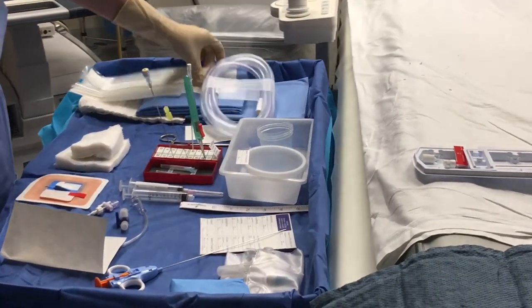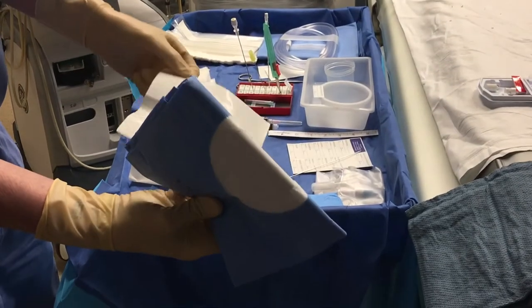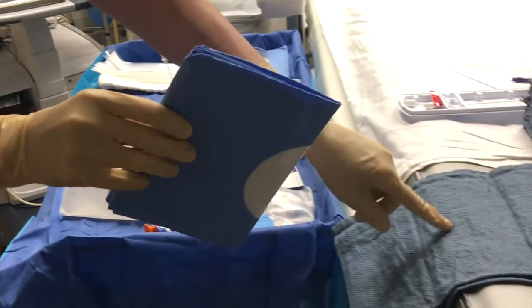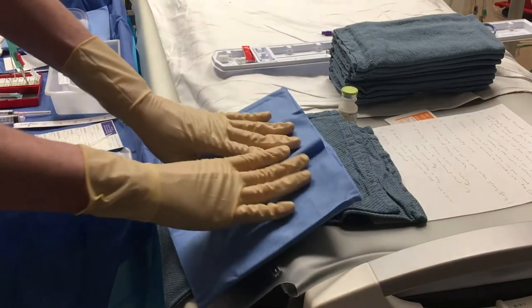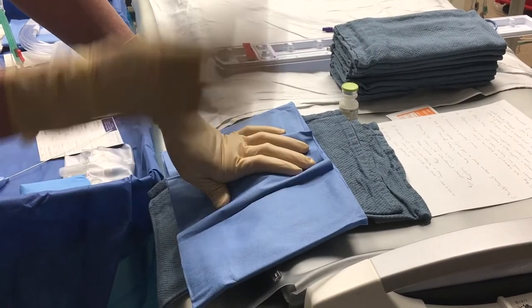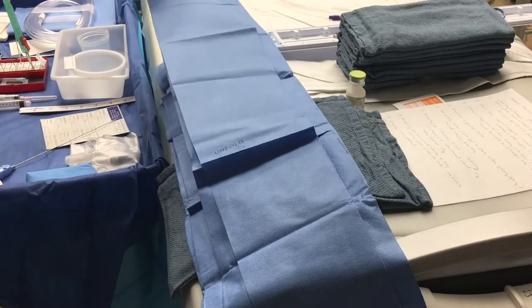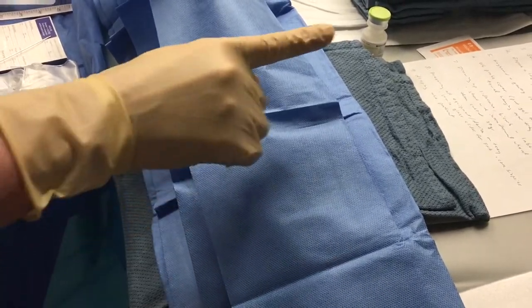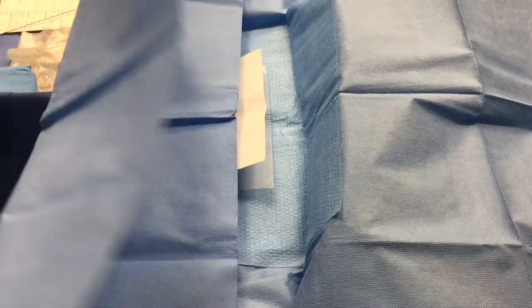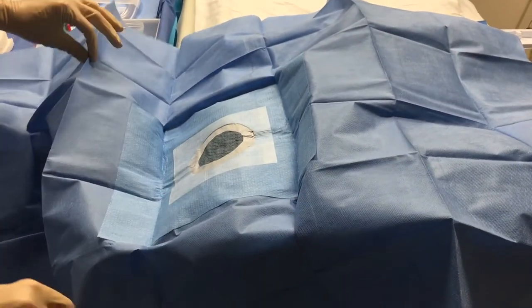We also have a larger eyelet drape that works the same way. Keep it completely folded, peel off the backing, place the sheet where you're going to work on the patient's skin, then open it and press it firmly so it sticks. Because we prepped early and the prep solution has dried, this will stick nicely. Unfold the drape — notice arrows on it indicating which way to open it. Pull the drape in the direction of the arrows and remove the paper sheet to expose the sterile field.